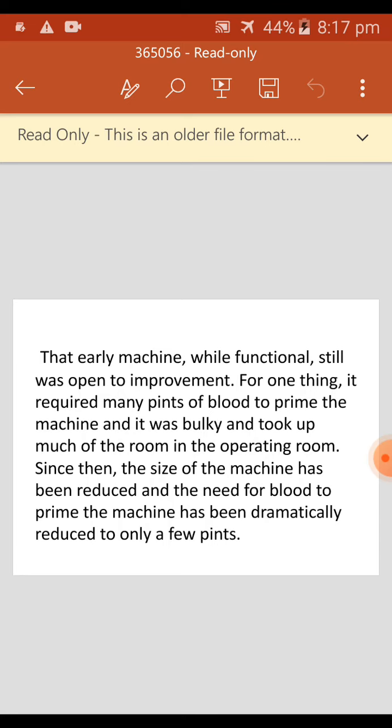Oxygenators and gas exchange function. The artificial lung, also called the oxygenator, takes over the lung function during ECC and is therefore responsible for the exchange of vital gases. Membrane oxygenators are now used as standard. They contain a semi-permeable membrane in the shape of a microporous hollow fiber. This liquid-impermeable membrane separates the gas side from the bloodstream. Due to the partial pressure gradients, oxygen and carbon dioxide diffuse through the microporous membrane.